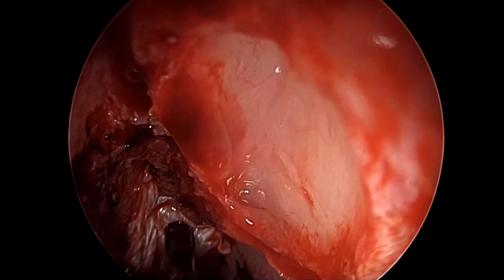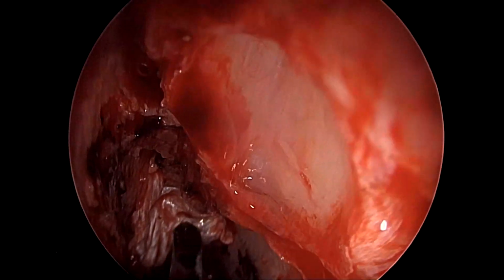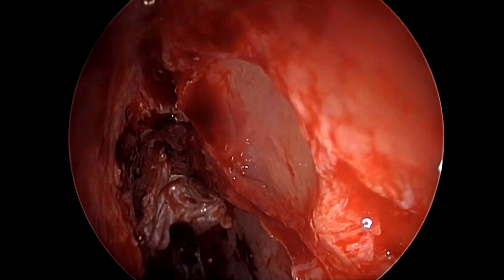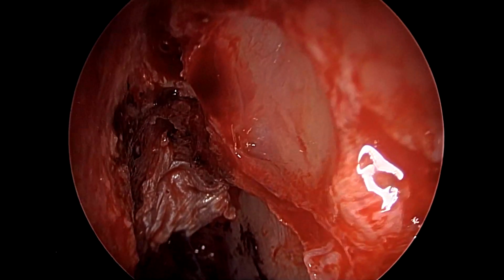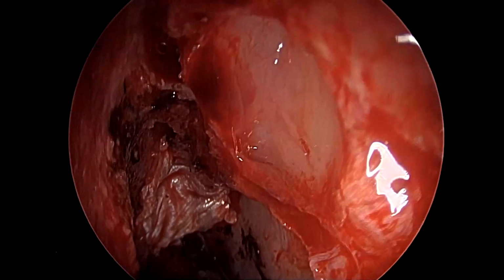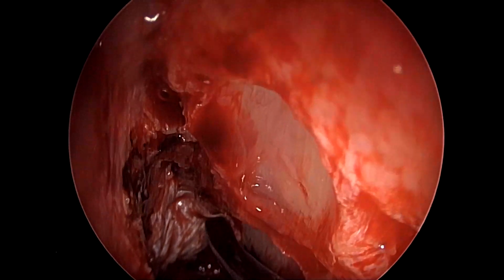Now, this fascia autograft, of course, has to be much larger than the previous one, because this has to ideally cover much more of the raw bone over that area, and that was the reason why we ablated much more bone than the size of the defect, for this fascia graft to be able to adhere to the bare bone.